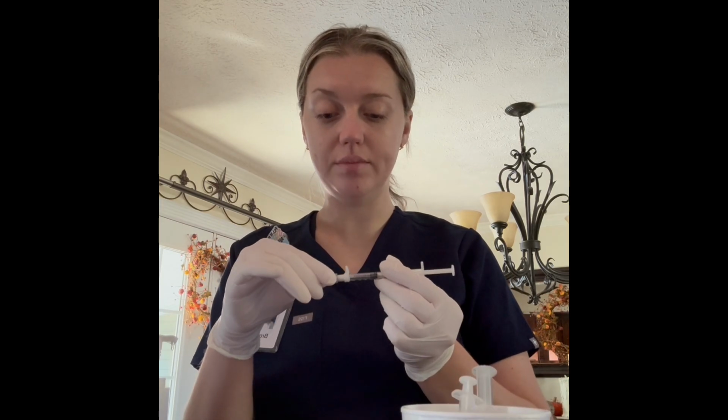This would be an intradermal, so I'm going to inject this at a 5 to 15 degree angle. I'm going to cleanse the site in an outward motion with alcohol, and then going to uncap the needle in the OK position, and then I would angle this at a 5 to 15 degree angle with my dominant hand, stabilize with my non-dominant hand, inject the medication slowly, and then begin removing the needle and cover with a piece of gauze with my non-dominant hand, engage the safety device with my dominant hand, and then I would apply pressure.